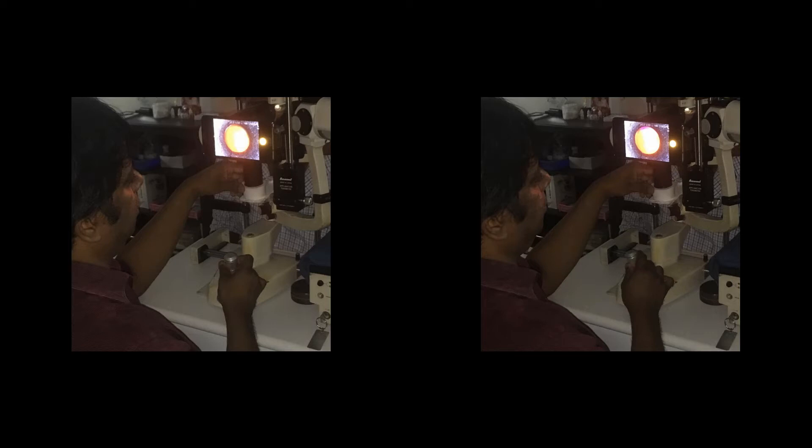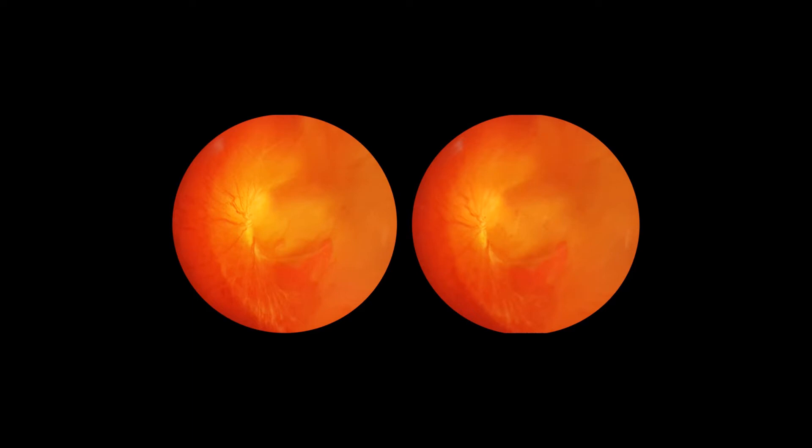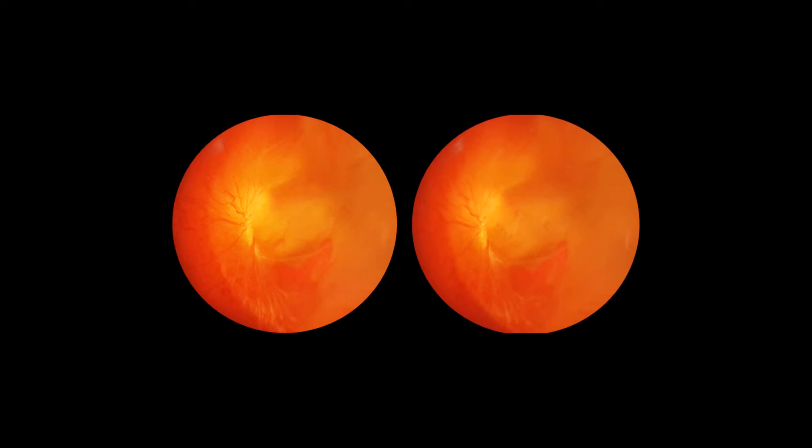There are two physiologic methods to view stereo pairs: the crossed view and the parallel view. This is a cross-view pair of a large neovascularization on the disc, and if one is able to fuse it by inducing a crossed diplopia by converging the eyes, it is possible to see the NVD as floating in the vitreous.